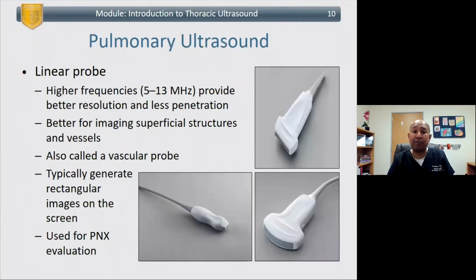So when you want to grab that probe, because we're talking mainly about pneumothorax, you probably want to grab the linear high frequency probe. Once again, a high frequency probe gives you awesome resolution, but you sacrifice penetration. That makes sense, right? Because if you're going to plop that probe here to look for a pneumothorax, you really want to identify that pleura. The pleura is not huge, so you want good resolution to find it. And it's a little more superficial, so you don't need deep penetration there.